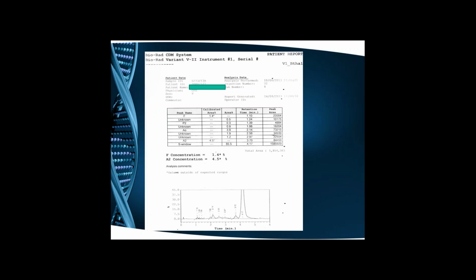So it's a straightforward case of sickle cell homozygous. But since she was a 45-year-old lady, totally asymptomatic, it's very, very unlikely that she could be a homozygous sickle cell. So what we did was, at this time, we repeated our test with a second sample. Next slide, sir.